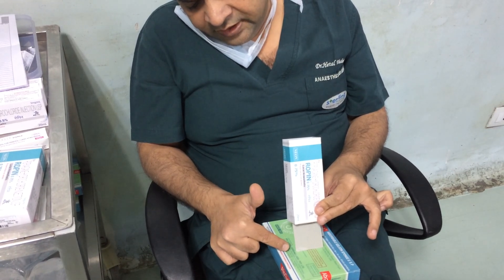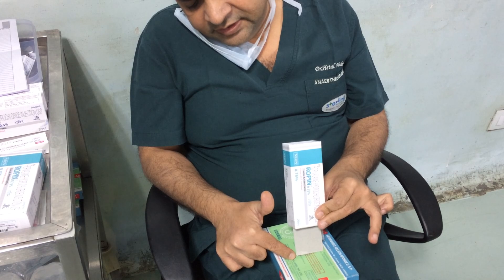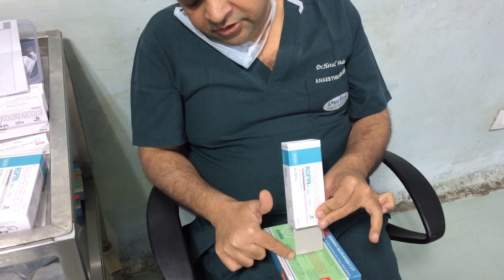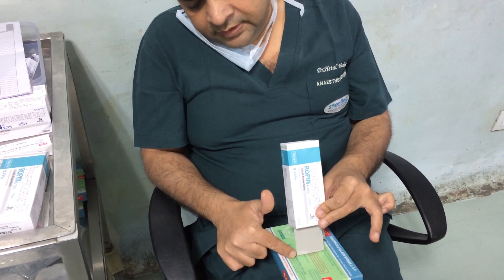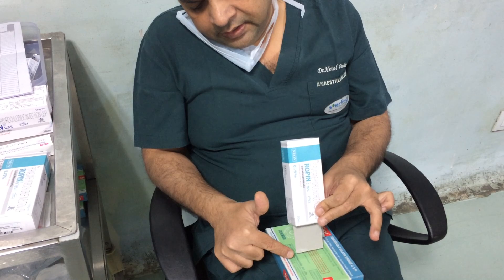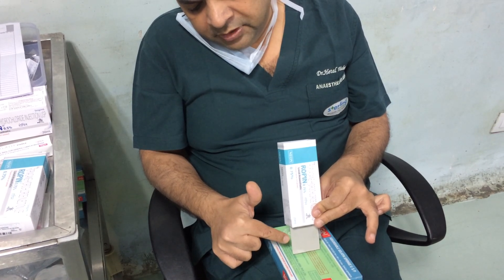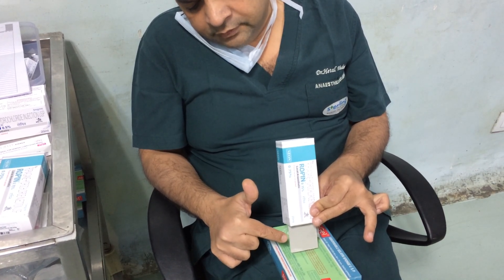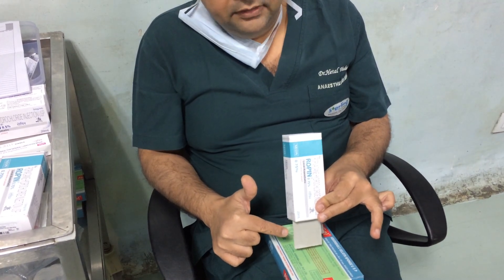Your needle entry will be somewhere shifted from the midpoint, and that is how you can visualize the needle — by accounting for the angulation and entering away from the midpoint of the ultrasound probe.